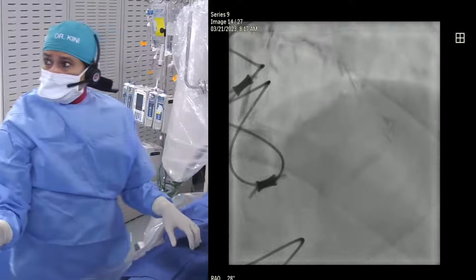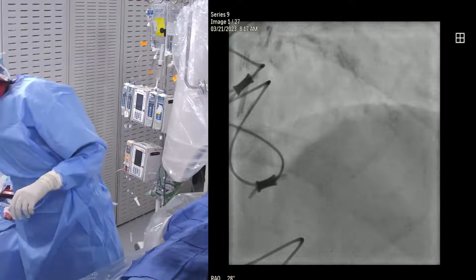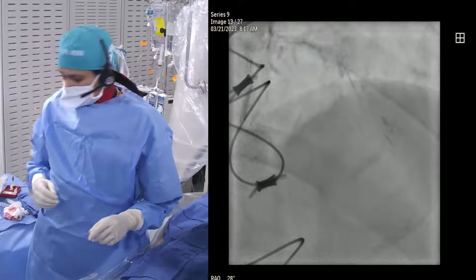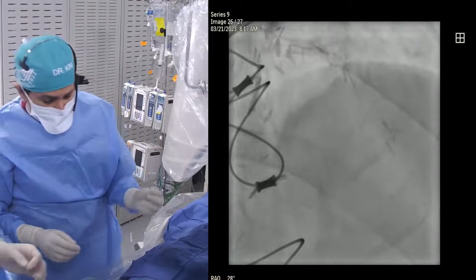Yeah, definitely in the middle at 12 o'clock, underexpanded stent. And so the idea is to put a Rota wire through and image. I'll do it on the Rota wire. OCT on the Rota wire. Okay, OCT will be done.